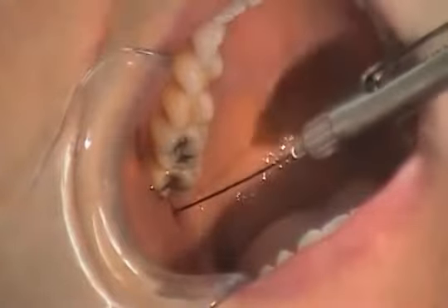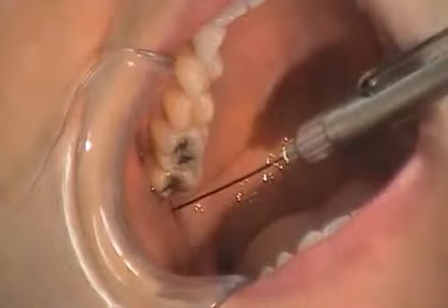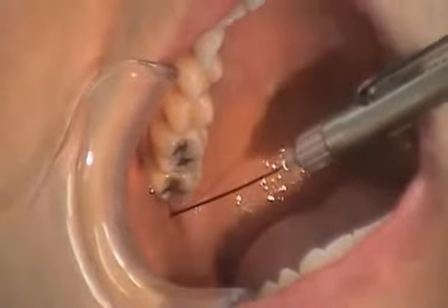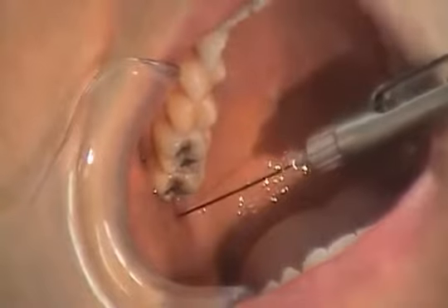Slowly advance the needle until bone is contacted. Bone contacted is the neck of the condyle. The average depth of penetration is 25 millimeters. If bone is not contacted, withdraw the needle slightly and redirect.